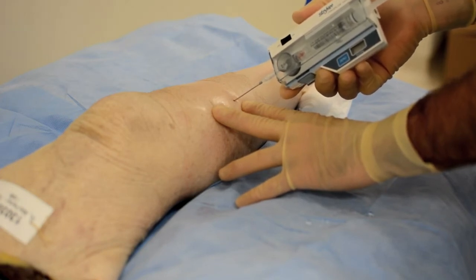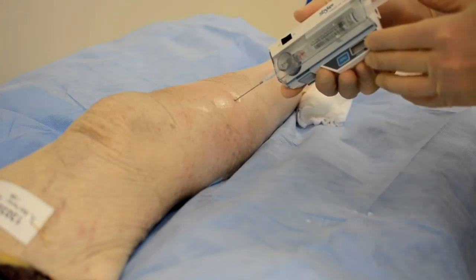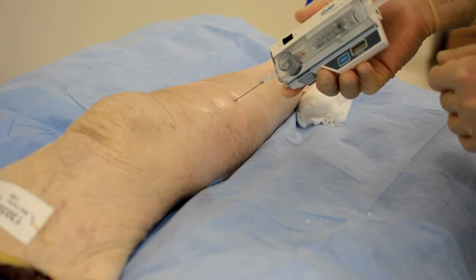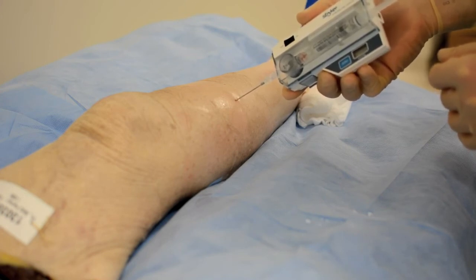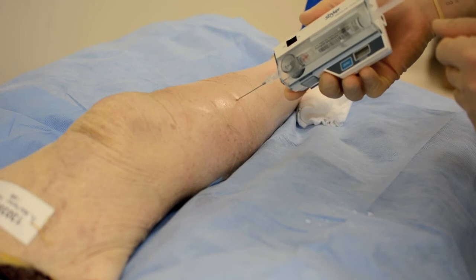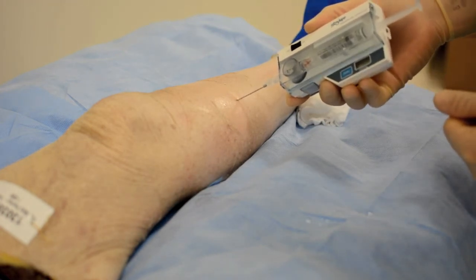Once you have placed the needle into the appropriate depth, you will inject 0.3 cc's into the compartment to establish a fluid column. It also is sometimes helpful to carefully back the needle out a millimeter to make sure there is no plugging of the side port or the end of the needle. You will allow the device to equilibrate and check your reading at the monitor readout.